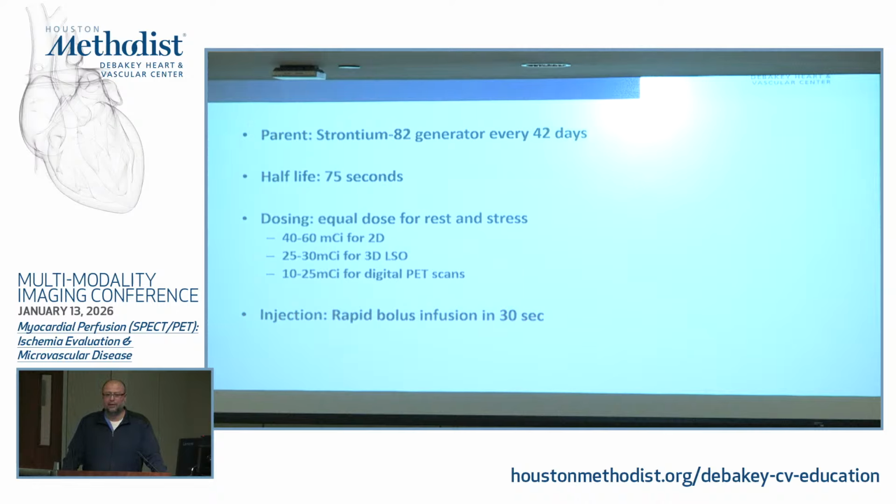There is no manual injection, so it's all by the machine. You go in there. It's like an iPad. You put how much you want to give the patient. I press inject, and it's all automated. The techs come 1 hour earlier every morning to do QC to the machine, make sure that it's working fine, and then they can do it.